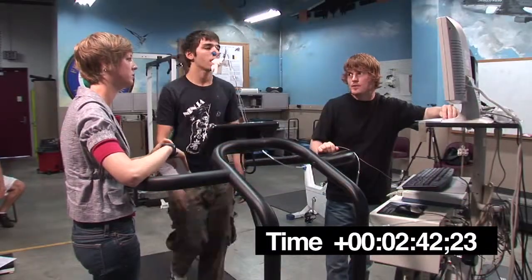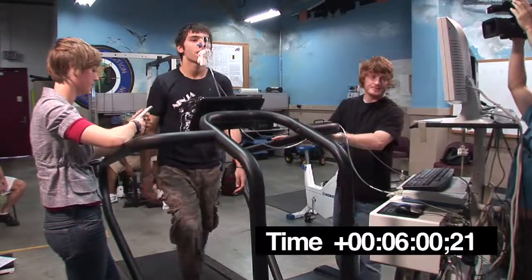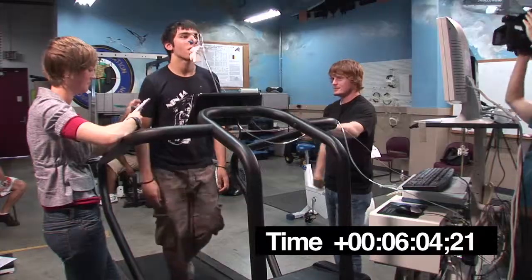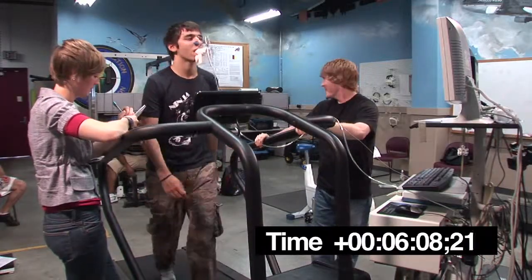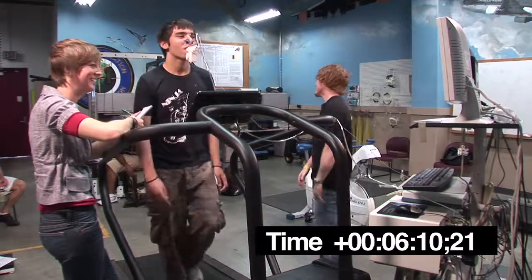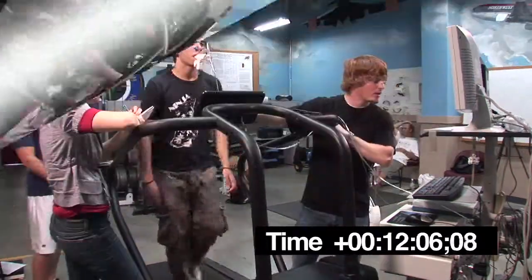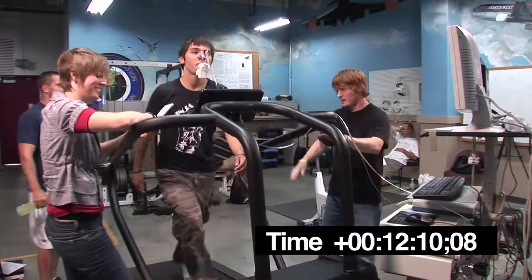What does the evaluation look like? Five. How are you feeling?